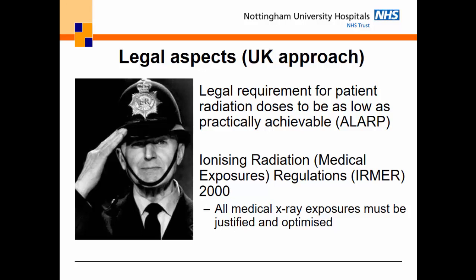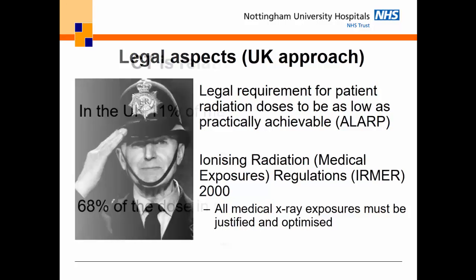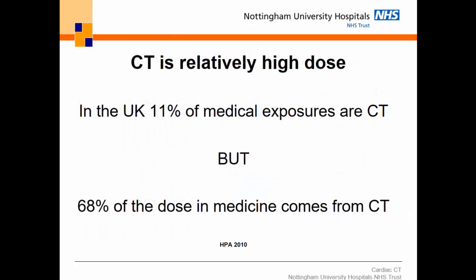So the requirements certainly in the EU are going to be increased. Okay, so CT is relatively a high dose technique. You're probably aware of that. In the UK, about 11% of exposures are CT. That's increasing all the time. But actually 68% of all the radiation dose in medicine comes from CT. So if we're going to optimize anything, you start with CT.